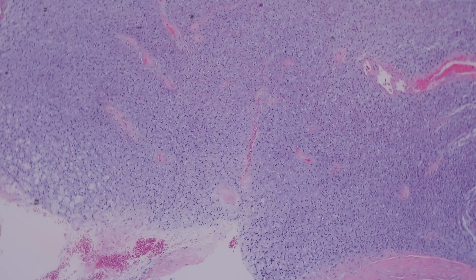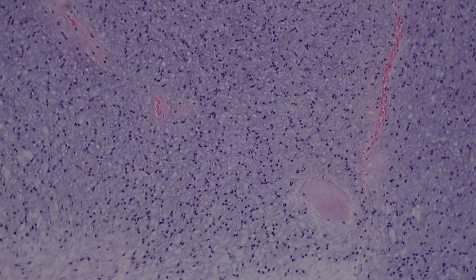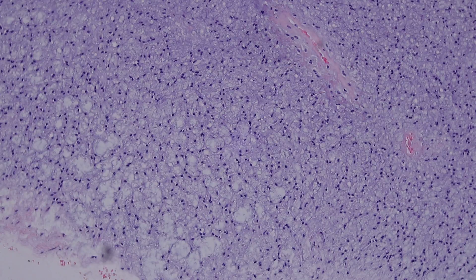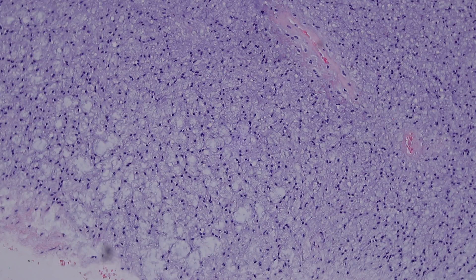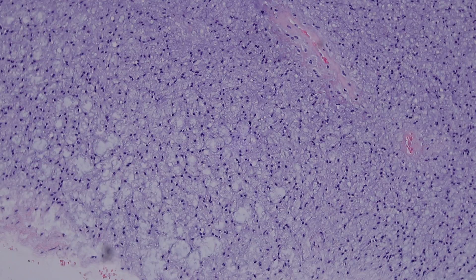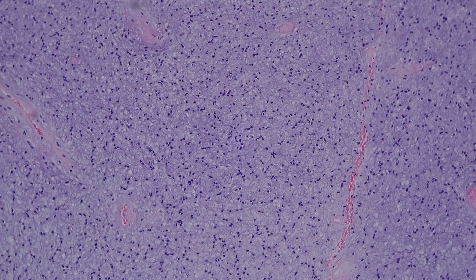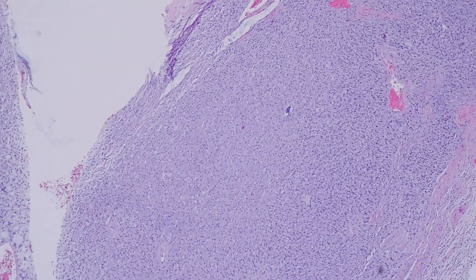Here's an example that looks quite different — it's very blue and myxoid. Sometimes they are very fibrous, other times very myxoid, but you can still see the cells arranged in cords and chains. A very myxoid tumor like this could make you think of myxoid liposarcoma. But one big difference is that in myxoid liposarcoma, although it also has small uniform cells because it's a translocation-associated tumor, it doesn't tend to make cords or chains — the cells are very spread out and don't hook up in rows. So a myxoid tumor with round to spindled cells in chains is usually not myxoid liposarcoma. Molecular testing can help if you're struggling.